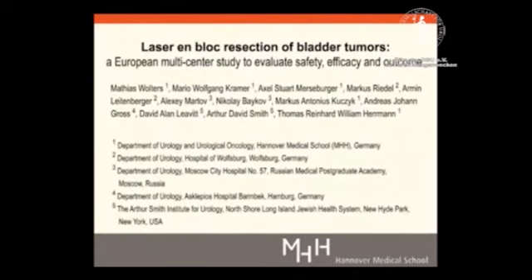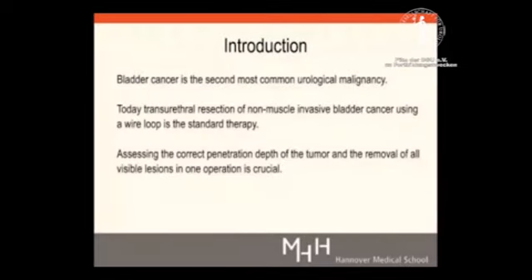Laser en bloc resection of bladder tumors, a European multi-center study to evaluate safety, efficacy and outcome. Bladder cancer is the second most common urological malignancy. Today, transurethral resection of non-muscle invasive bladder cancer using a wire loop is the standard therapy.